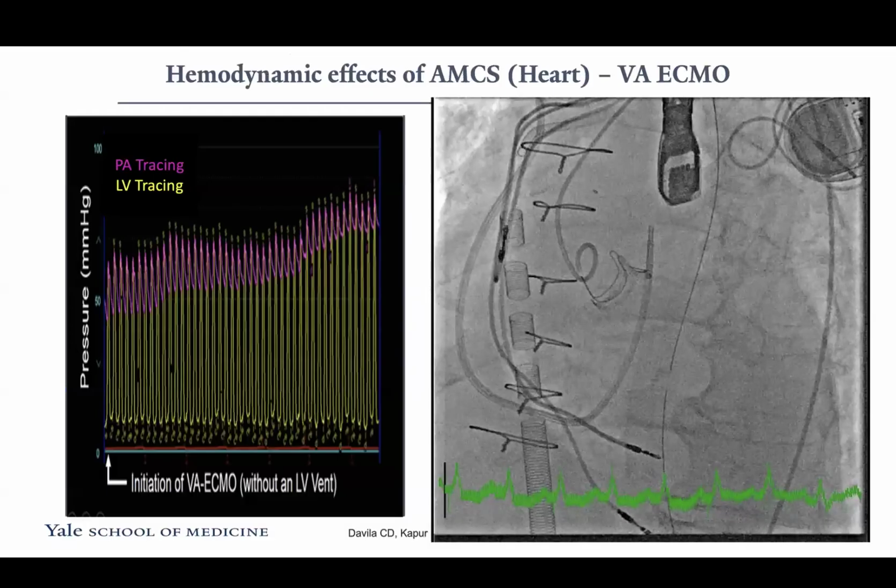All right, yeah, so that's clear. So if you have an ECMO pump that is pumping blood against the heart, right? You should identify what they call the mixing cloud. Where is the flow from the ECMO mixing with the flow from your heart?